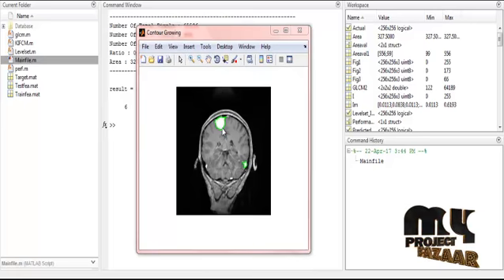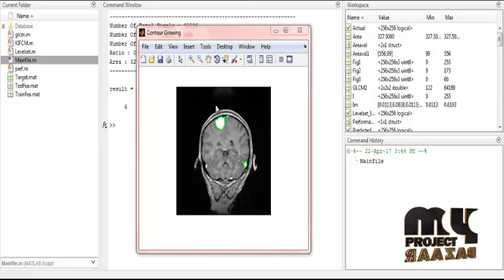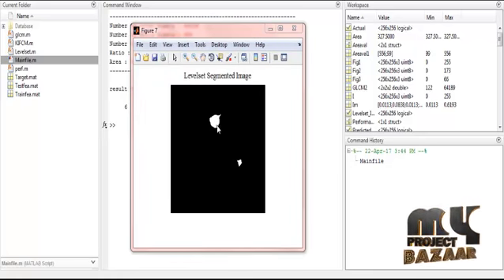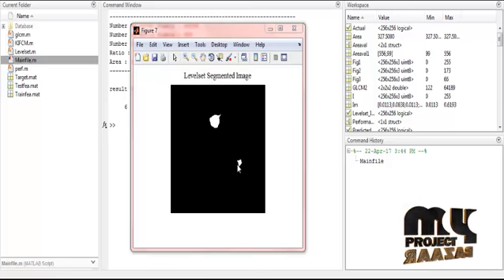And then contour growing. The contour growing is calculated over the image region by using MATLAB. The tumor part will be detected, and then how the tumor will grow or be upgraded is shown by the tumor growing. So the contour growing is calculated from the tumor region of the disease in the brain tumor. Another segmentation is thresholding. In the thresholding process, we use level set segmentation images by extracting the tumor. All the brain image is removed, and only the exact tumor region is selected, and then the level set is calculated using the level set segmented images. That is one type of thresholding process.